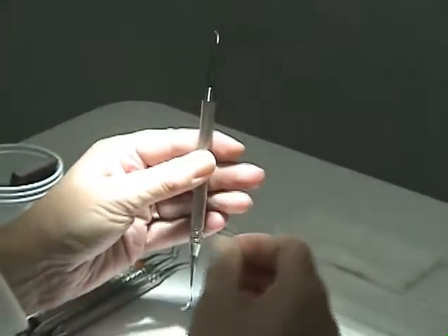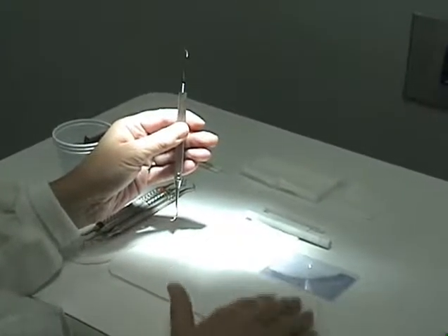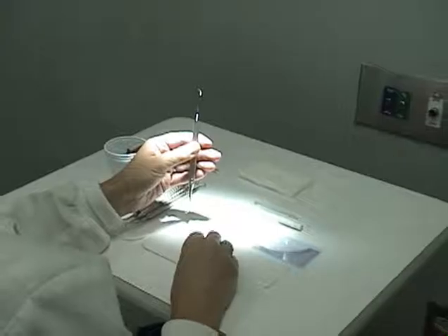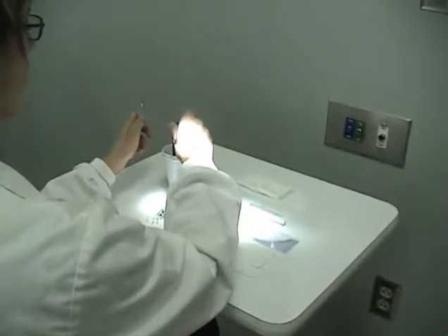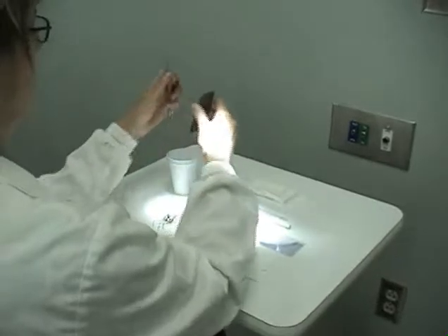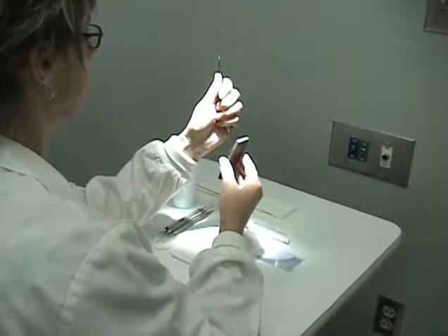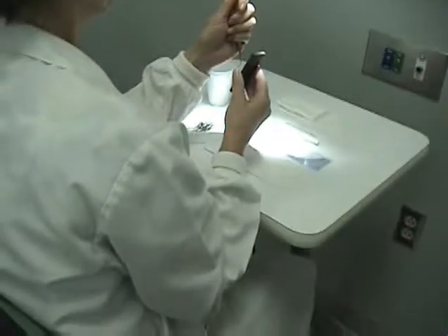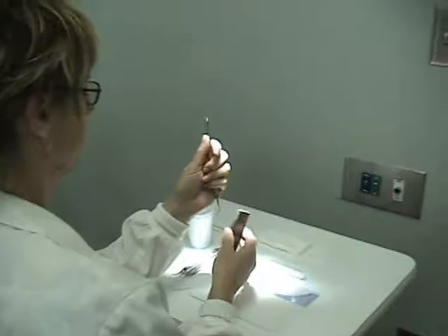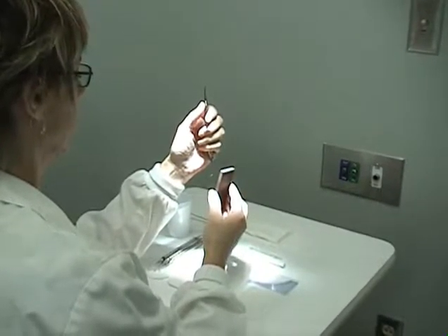Your work area should be well lit. It should be a table or counter high enough so you can place your elbow on the table and hold the instrument within eye level. If you don't have a counter, you can hold your arm against your body to stabilize your instrument while you're sharpening it.